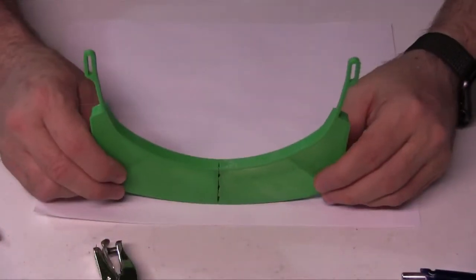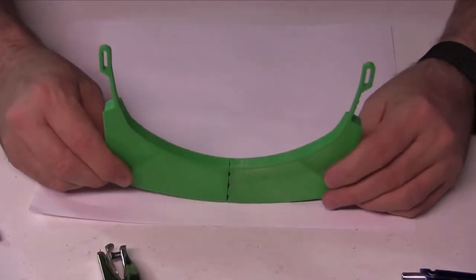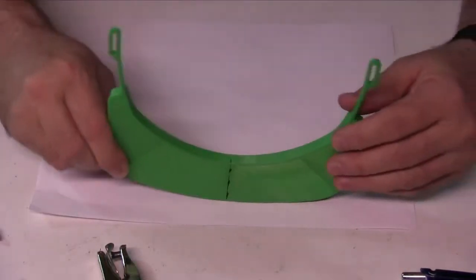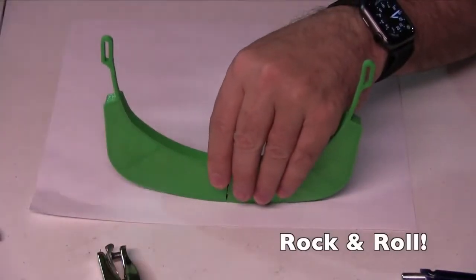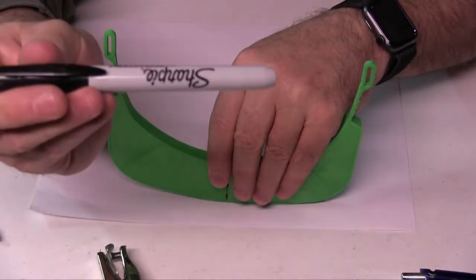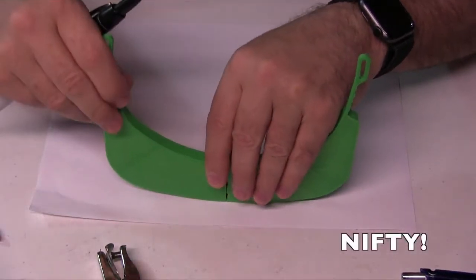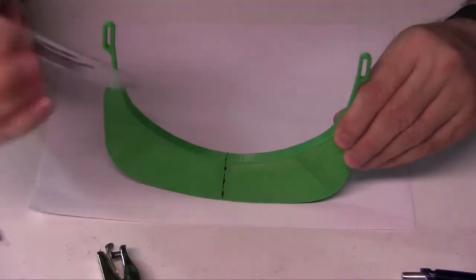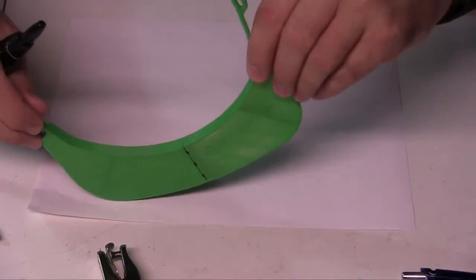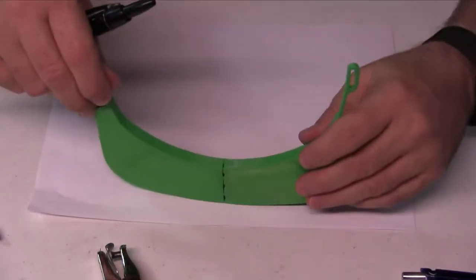So here's the top edge of the paper, and here's the PPE. You notice that it kind of rocks a little bit here, and I'm going to try and do this really effectively. I have a Sharpie that actually goes like that. This is a valuable tool here, getting a Sharpie. So we're going to make markings on this sheet of paper going across like that.